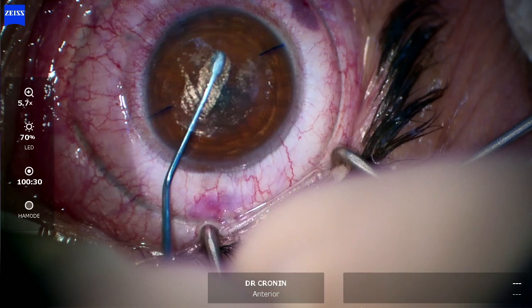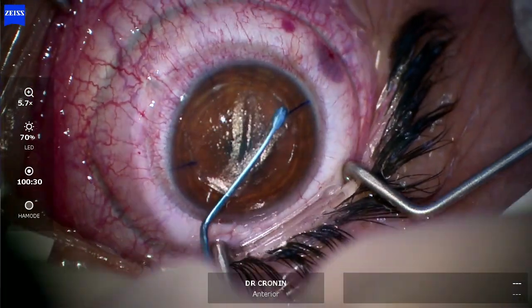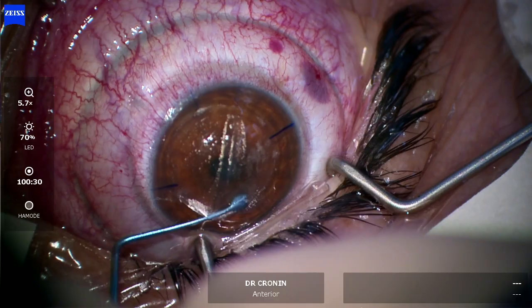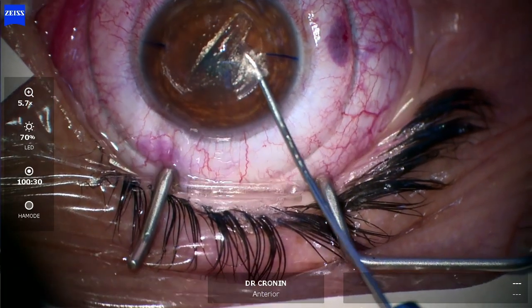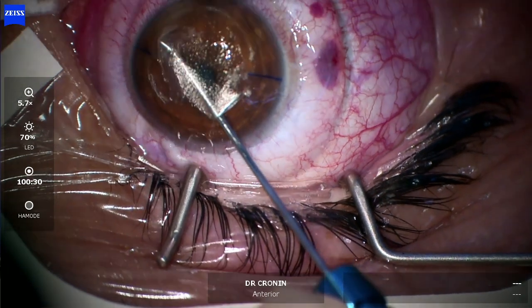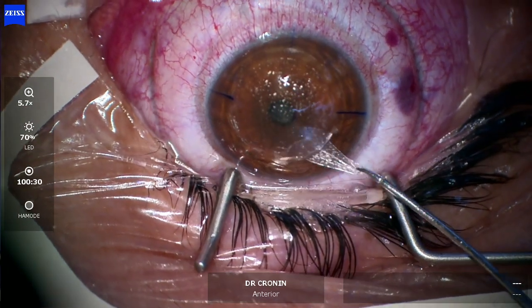You then dissect on the posterior plane of that lenticule, ensuring you get all the way out to make sure that lenticule is nicely dissected, and then carefully remove the lenticule in a capsulorhexis-type movement. You can't just pull it out — you don't want to leave any residual components of lenticule.